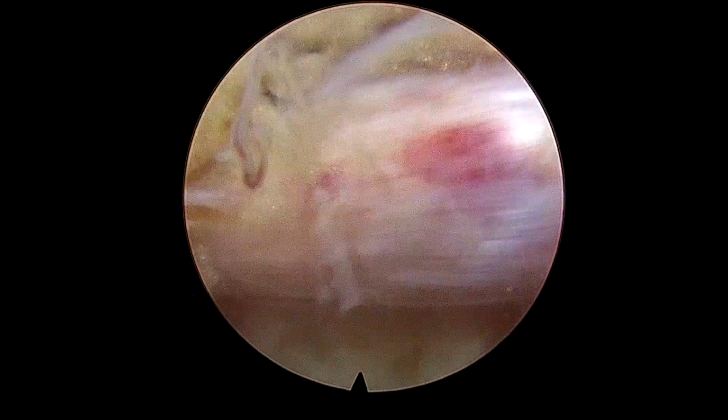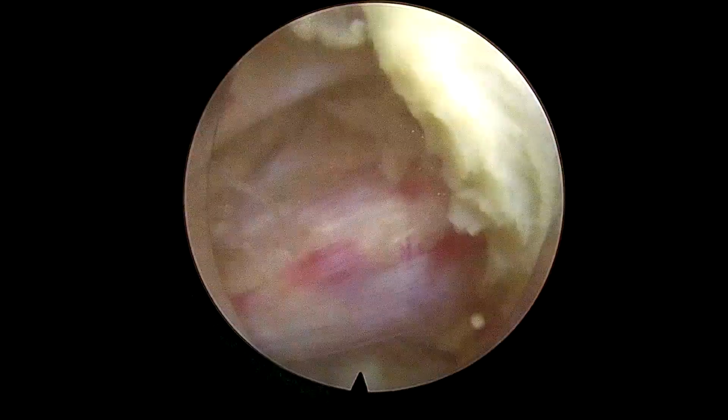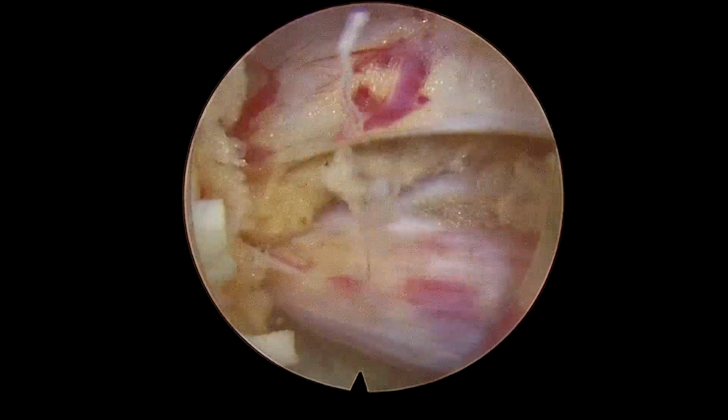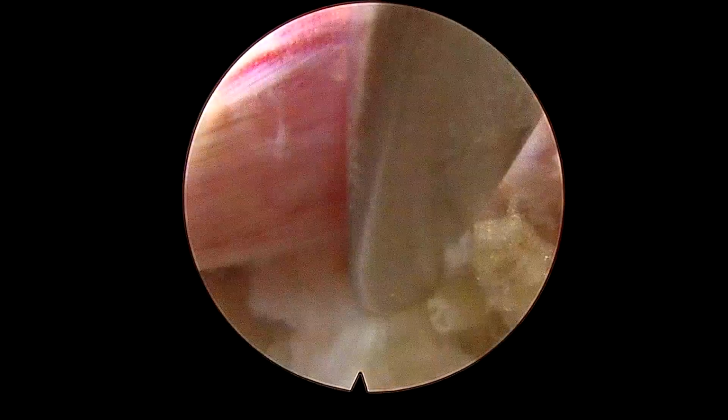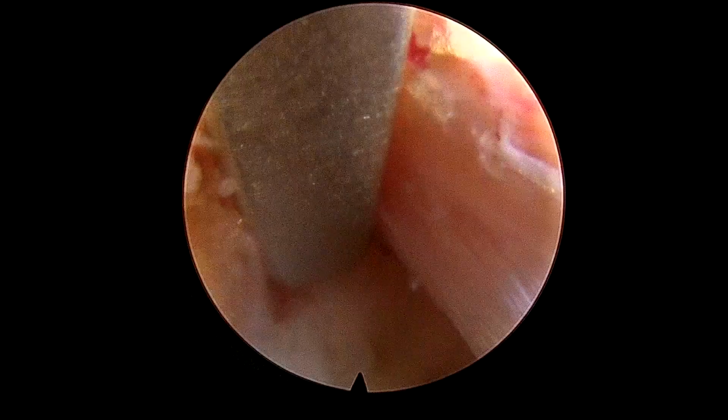In this particular case we haven't done any bony decompression, the reason being a wider interlaminar window. We just removed some part of the ligamentum flavum. So I can easily retract the traversing nerve root medially with the dissector. There is no underlying disc fragment.